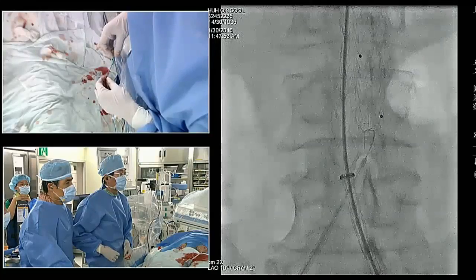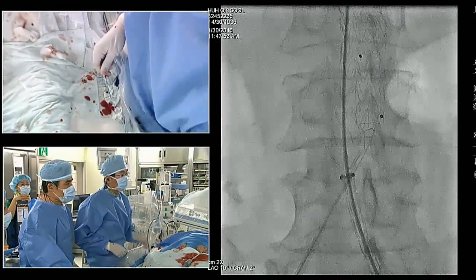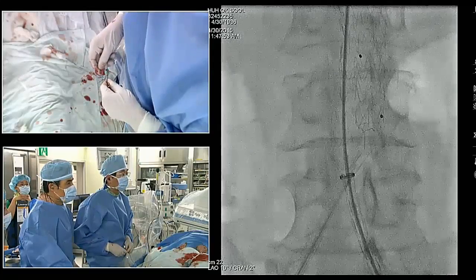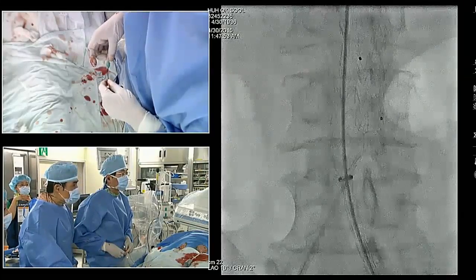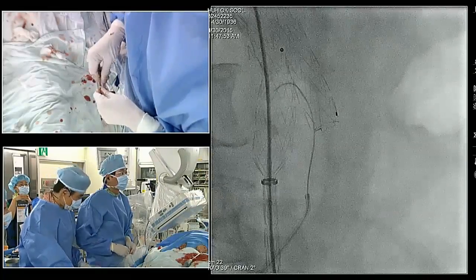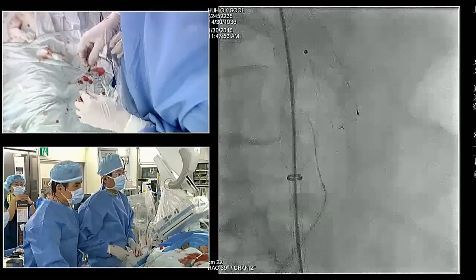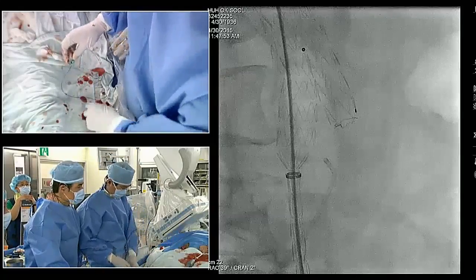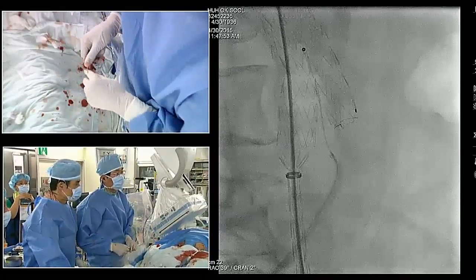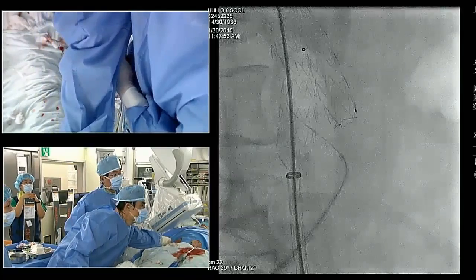May help to pull the diagnostic catheter back a little bit. There you go. Why don't you use some other projection? Good. It's not in. It's okay. You might need to sweep the diagnostic around. You should feel very comfortable. We've all been in this situation, and all the maneuvers that you're doing, we've all done in our careers.